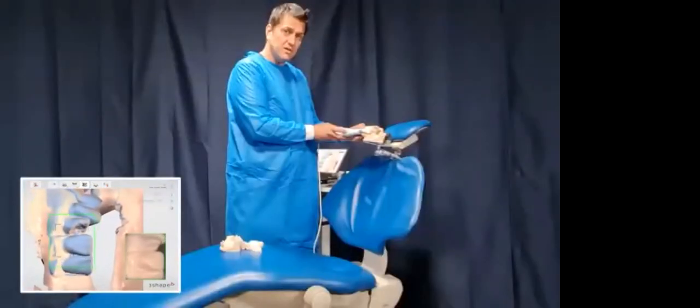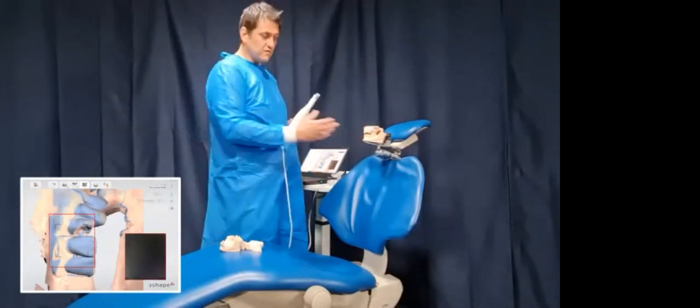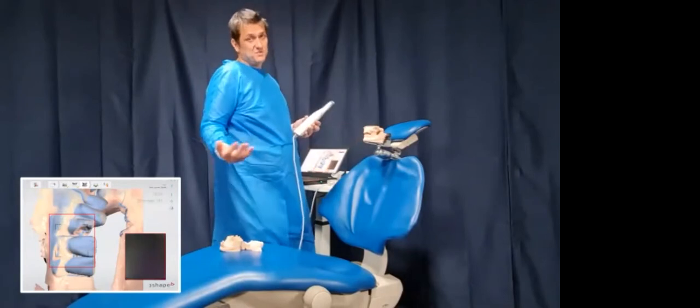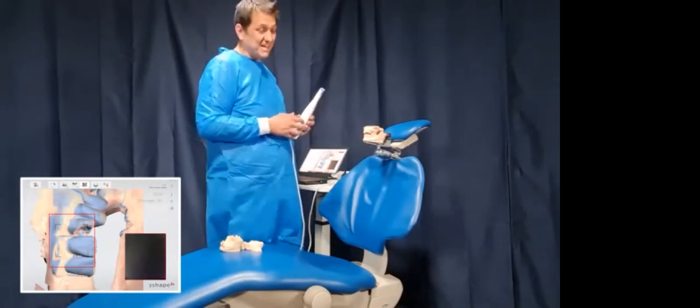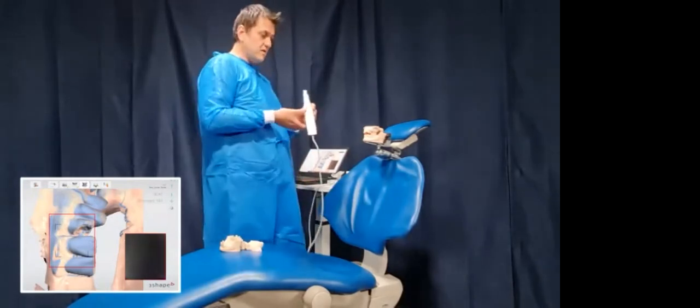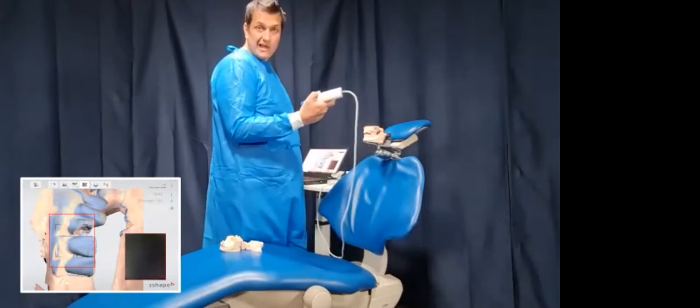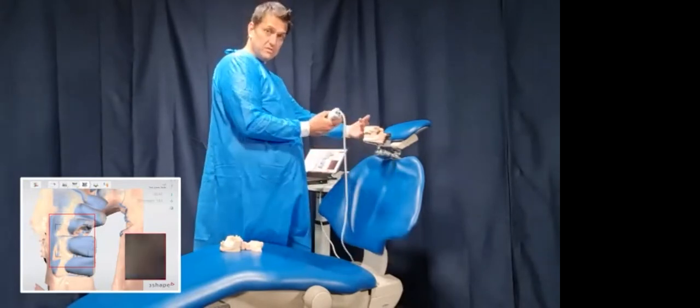Cameraman, thank you. And then what I do is I actually then take the scanner away. I take it out of the mouth. So I've come to the midline, and again, this is what this seminar is all about. It's about crossing the midline. I've come to the midline. I take my scanner out of the mouth. I then switch it. So I'm scanning like this. I then switch it, and I'm scanning now like this because I'm going to keep going this way.